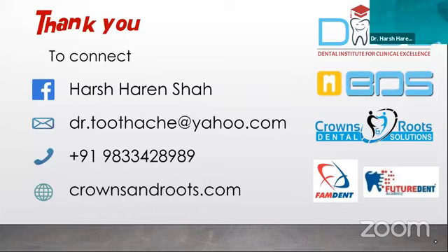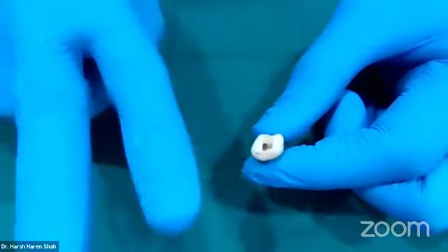So guys, what we are going to do is I have selected a maxillary second molar here. I did the access cavity preparation just a little while back, and I've located 3 root canals. I have already done the coronal preparation, that is the orifice widening. However, I have not performed any glide path preparation. We have located 3 canals, orifice widening has been done, good access has been done.